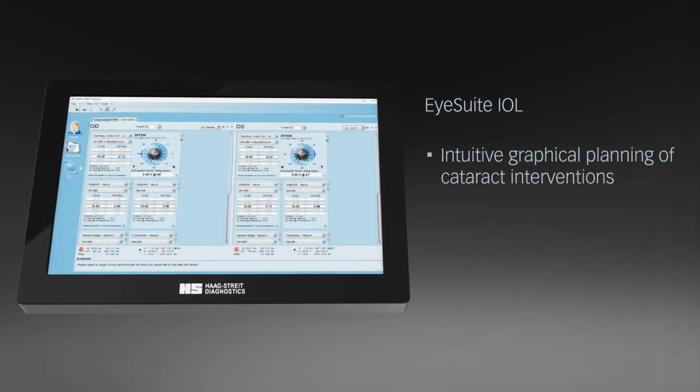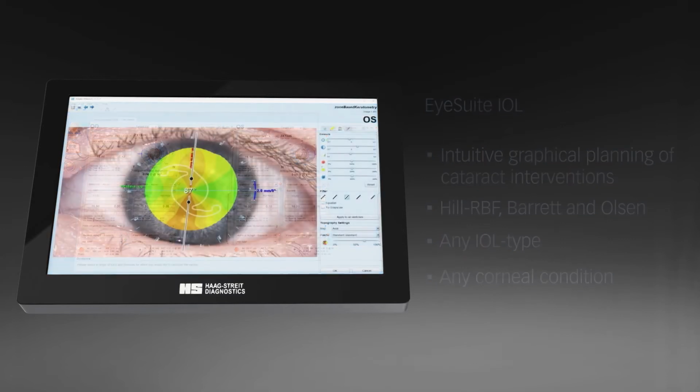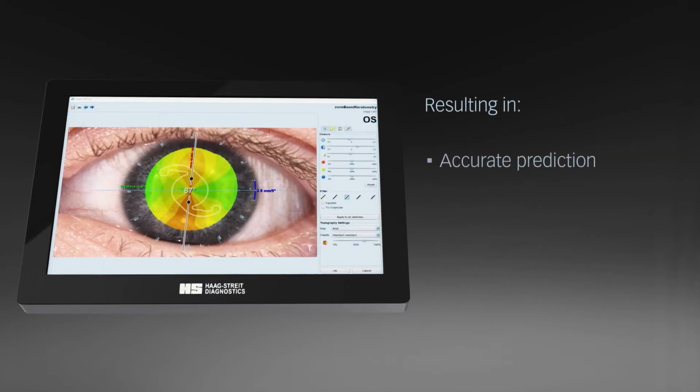When you do surgery, efficiency in your practice is one of the key points as well. Having this device allows you to delegate the measurement and then focus on the counseling of the patient to get the right procedure done, get the right implant or get the right surgical procedure.